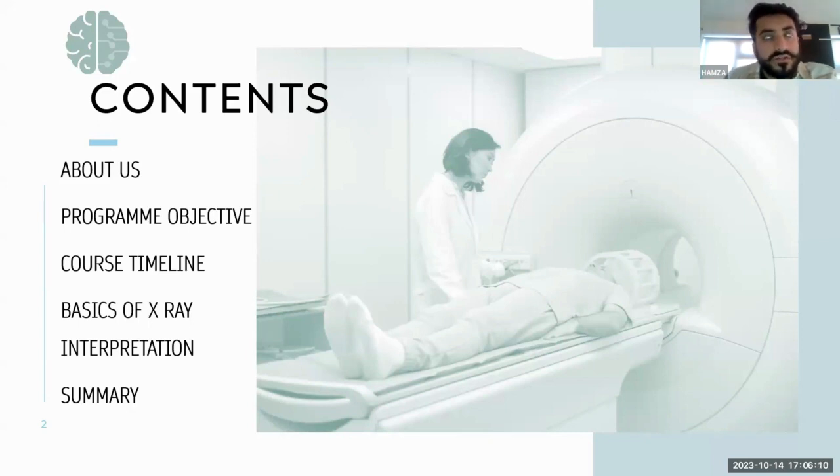As junior doctors in the UK, but also abroad, you're going to be expected to interpret many scans. Each of them has its own techniques, let's put it that way, to identify pathologies. Scans are crucial when determining management principles for each patient respectively. So as a result of that, knowing the basic principles is key in order to interpret your scans.